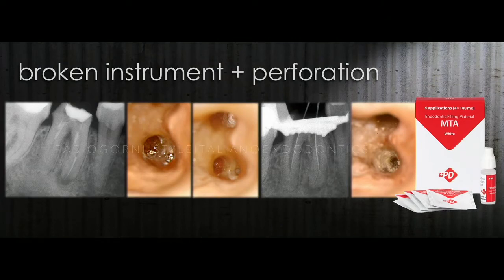A broken instrument in the apical third and a perforation in the middle third of the root, because the colleague tried to remove the instrument without any special equipment, and now we have to solve two problems. We have to remove the broken instrument and repair the perforation. Of course, when this happens, our problems are more than one, and the difficulty of the case increases a lot.